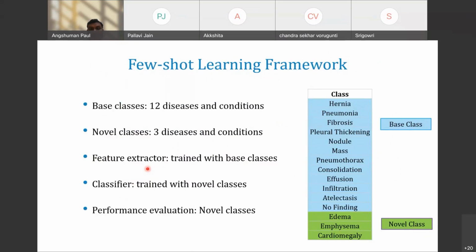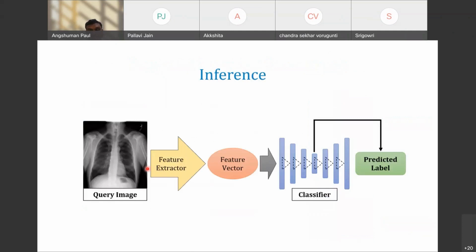Sir, one doubt, sir. In the previous slide, the autoencoder will give us a representation. The middle layer gives us the deep representation, which we use for predicting the label.